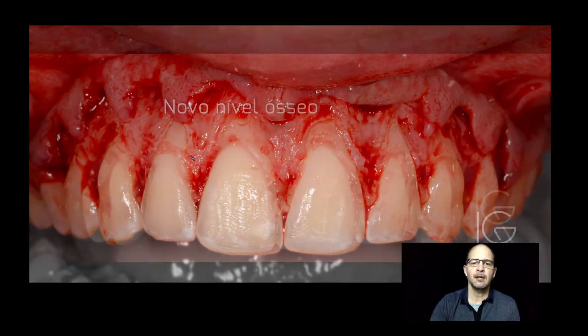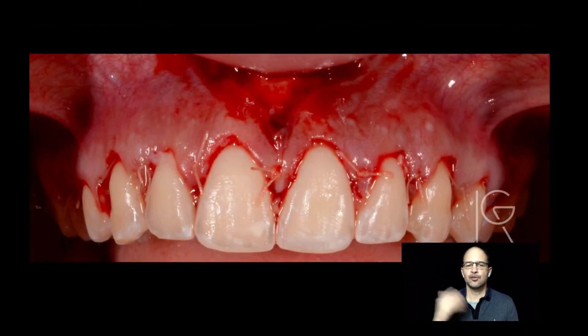I use a technique that I'm going to show you in a little bit to remove this bone in about 15 minutes. And then suturing at the end. And this is the patient before and this is the patient after.